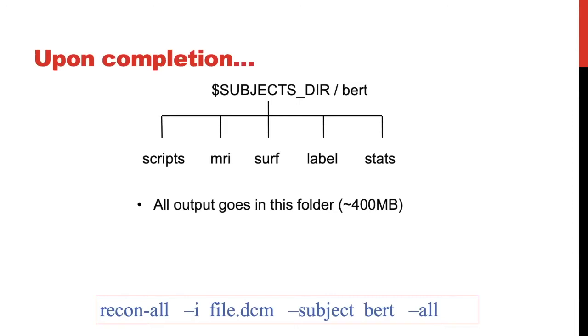So it's important to keep that in mind when you're reconstructing your subjects, and you want to make sure that you have enough room on your computer to see all of these subjects to completion. And so it's just important to keep that in mind.